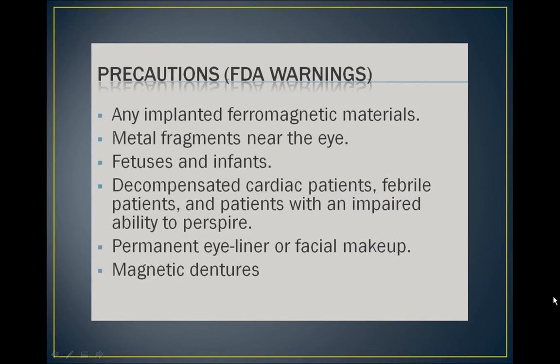There are many items that are not contraindicated for an MRI exam, but the FDA still has warnings for. Some of these include metal fragments or foreign bodies in or near the eyes, fetuses and infants, decompensated cardiac patients, febrile patients, and patients with impaired thermoregulation. Patients with magnetic dentures, or patients who have had permanent eyeliner or facial makeup applied, and patients with tattoos may also fall into this category.